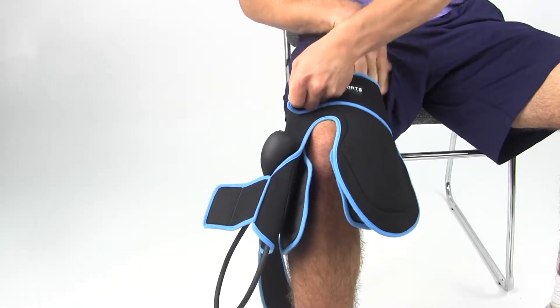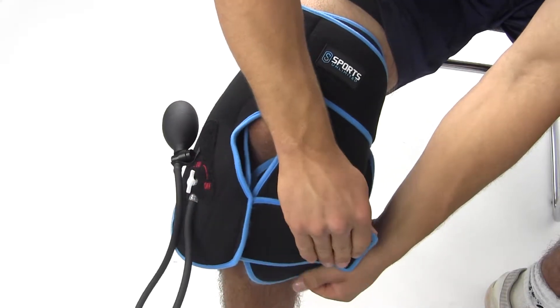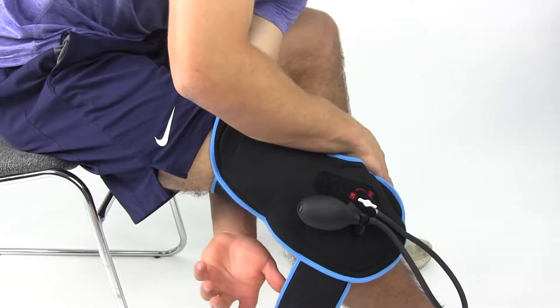To use the wrap, take it out of the freezer and place it over your knee. Fasten the velcro straps over the thigh and around the upper shin.